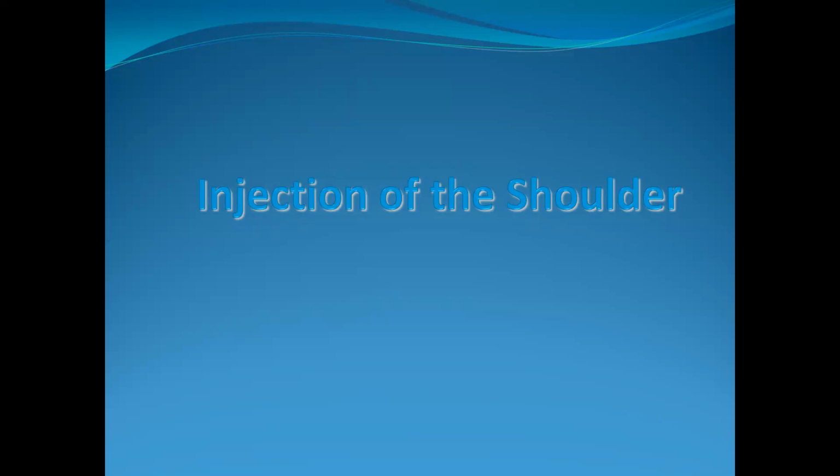There is a question from Dr. Nema, where she is asking, when there is no knee effusion, what is the preferred approach for injections? The best approach, as I said, is the lateral mid-patellar approach. The joint is almost superficial. Just enter, and it will be inside the joint.